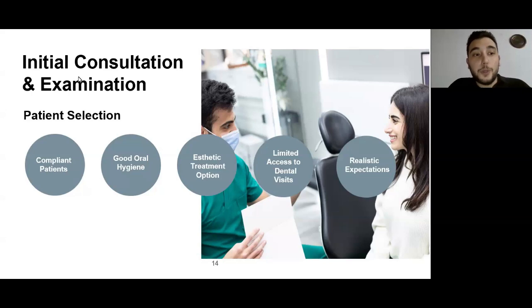So for the treatment duration, where the patient's expectation was high, you need to set the right expectations. You need to know what certain types of malocclusions are going to be smooth treatments that are predictable with minimal refinements and follow-ups, and what treatments are going to need some intervention and refinements after the initial set of aligners.